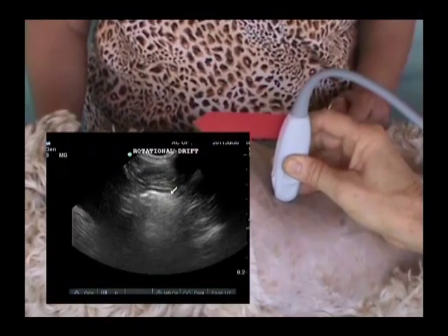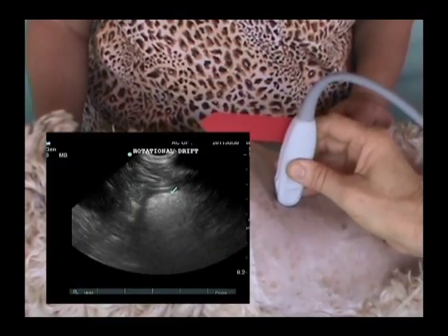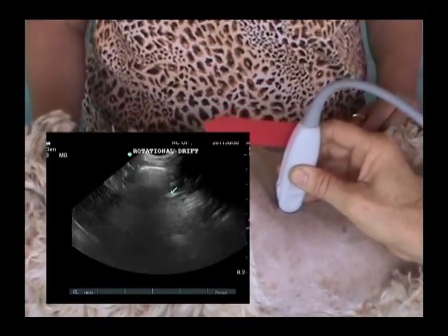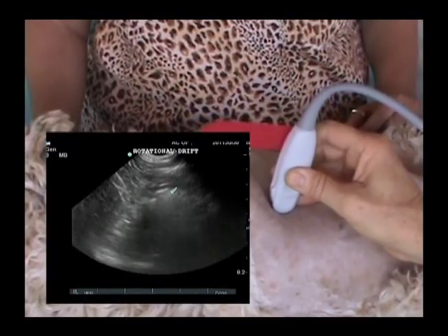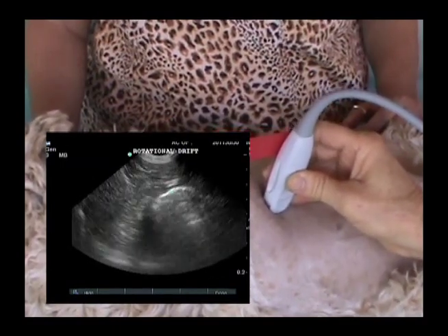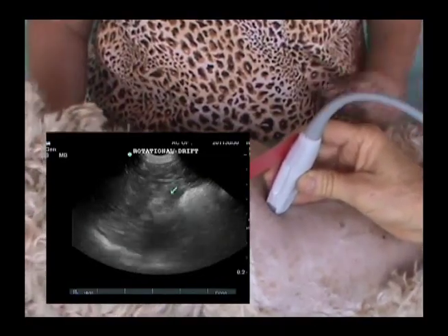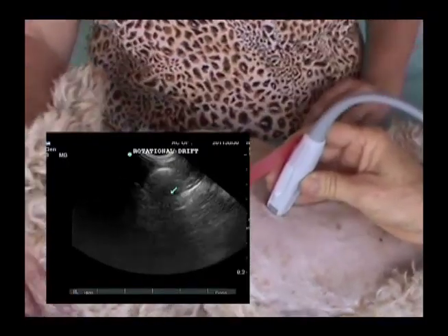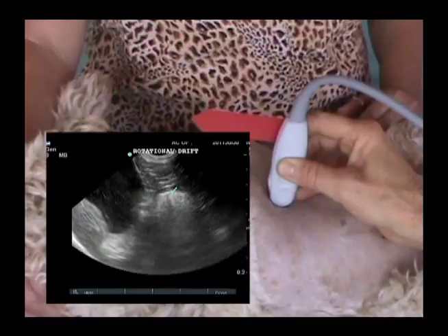I would like the stomach to remain at the green arrow on the ultrasound screen. For much of the ultrasound examination, the transducer hand is held in an unnatural position with the wrist extended. Once the organ of interest is located and centered on the ultrasound screen, most people relax. The wrist begins to relax to a more natural position. The transducer slowly rotates, and the image begins to drift. Watch how far I must rotate the transducer to return to the original view of the stomach.